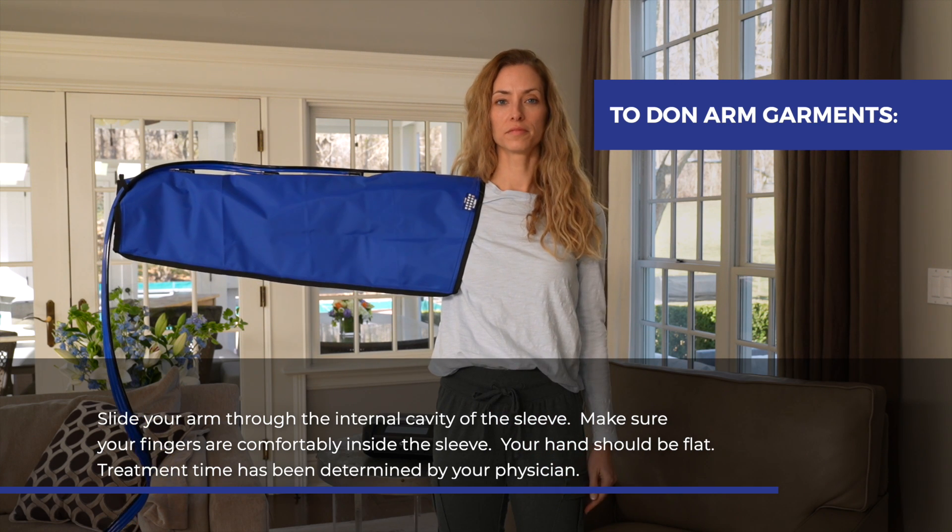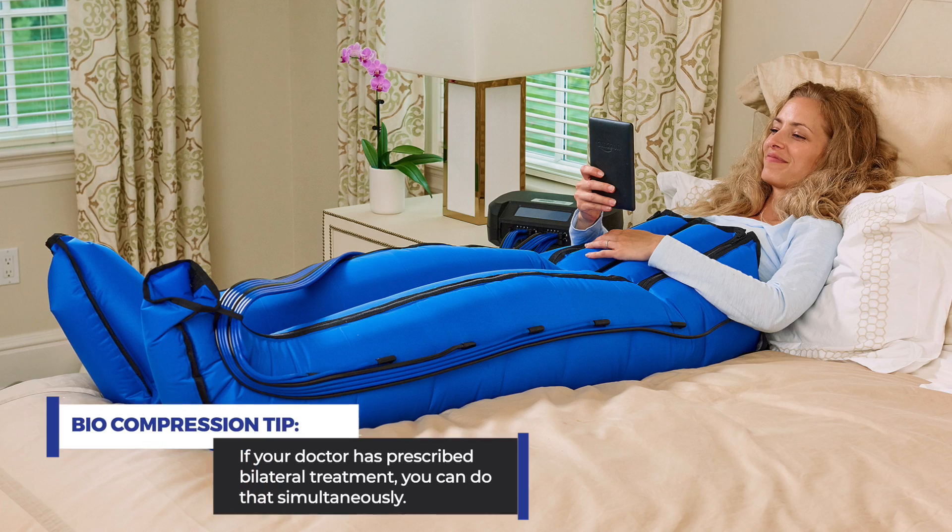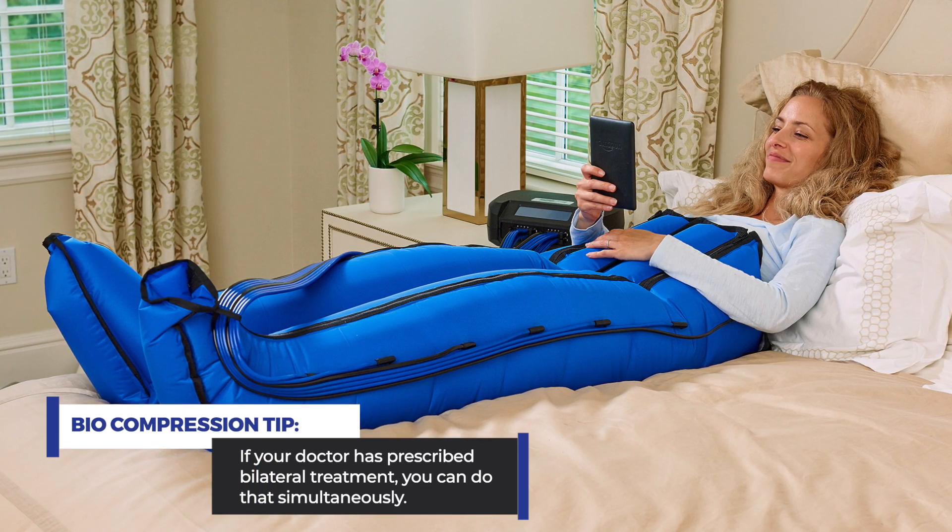Treatment time has been determined by your physician. If your doctor has prescribed bilateral treatment, you can do that simultaneously.